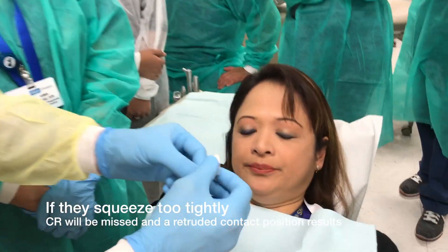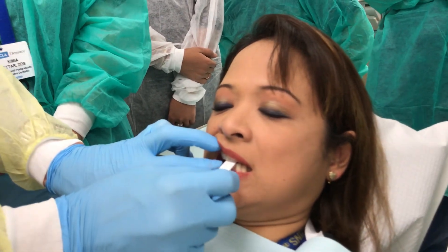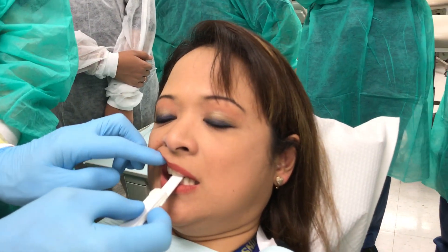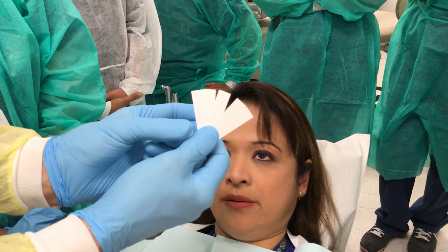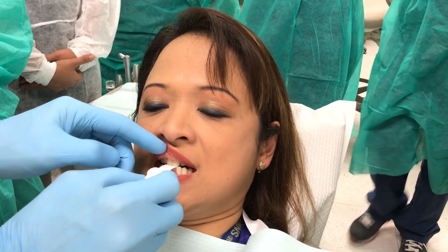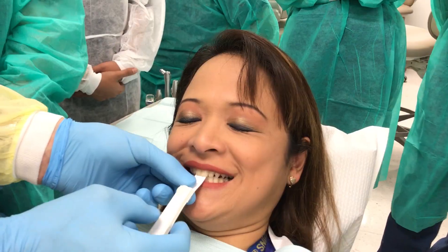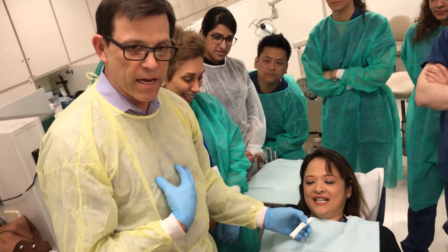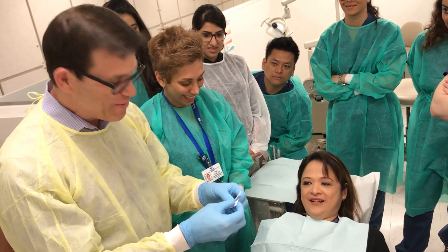Open for us again. Tina's got a pretty well-equilibrated dentition, so she shouldn't have too much of an interference. Slide forward, slide back, half hard bite — anything hitting there at all? Open for us. We'll go down to a few more leaves. Now we're down to really five leaves — so this could be as little as less than a millimeter. Bite together, slide forward, slide back, half hard bite — anything touching at all? Open. Now I'm down to three leaves.